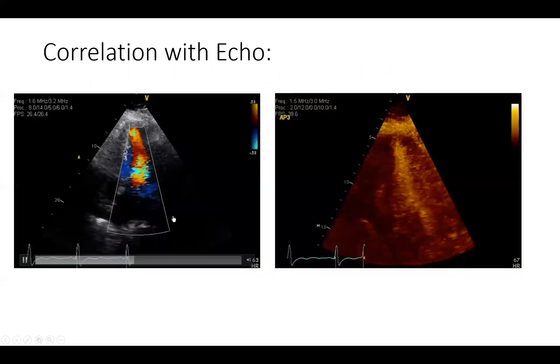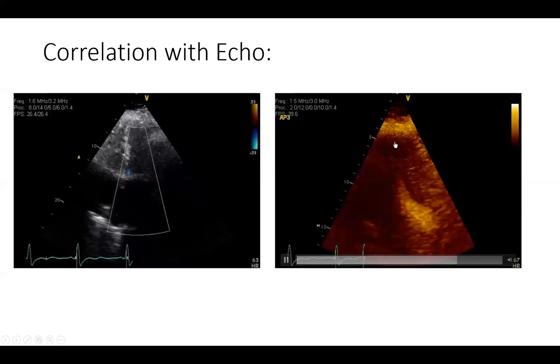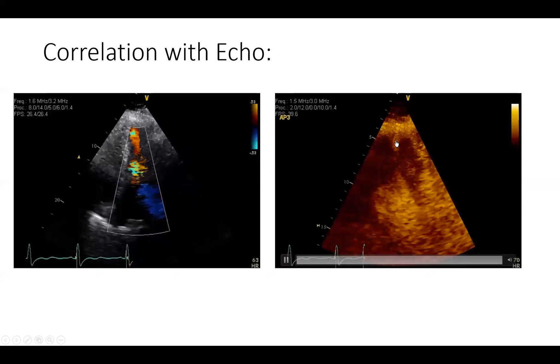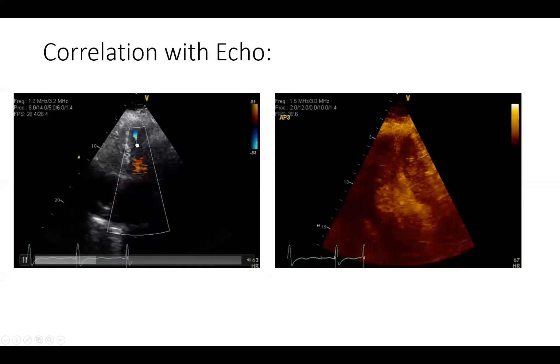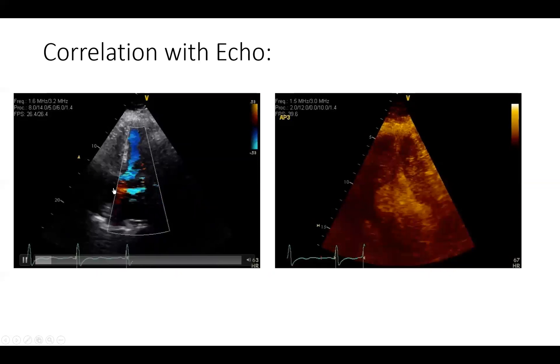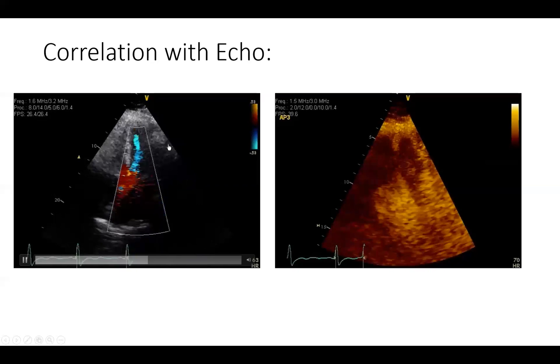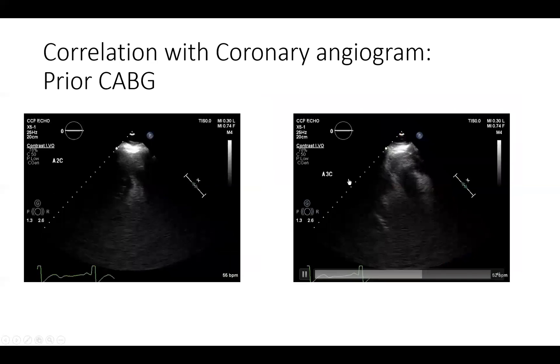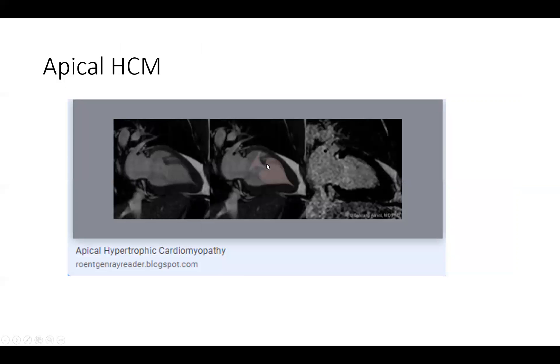However, when you go to the echocardiogram that this patient had, starting on the right hand side with contrast echo, you can see obliteration of the left ventricular cavity from the mid part onward, with residual contrast in the apex indicating a small apical aneurysm. When you look here, this is a very distinct and pathognomonic pattern seen on echocardiography — instead of flow going from the apex to the base exiting into the aorta, you can see reversal of flow of blood into the apex. This obliteration of the LV cavity creates a very thick, spade-shape appearance of the left ventricle, commonly seen in apical hypertrophic cardiomyopathy.